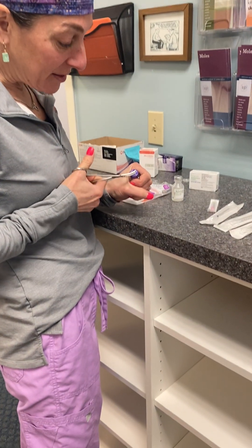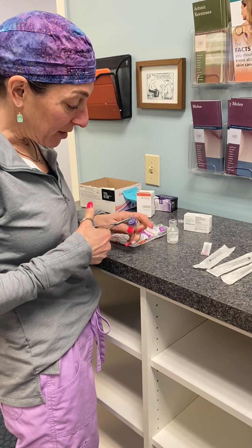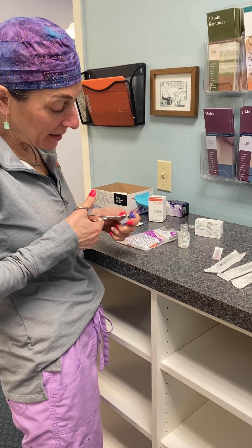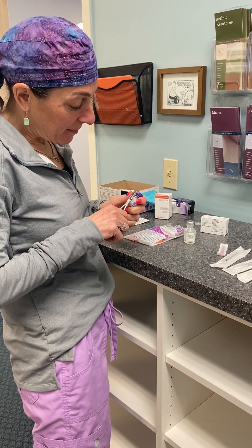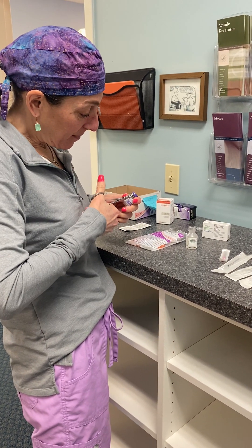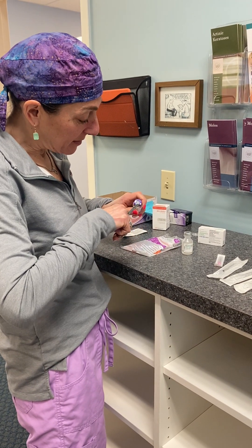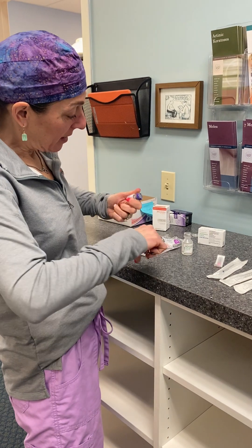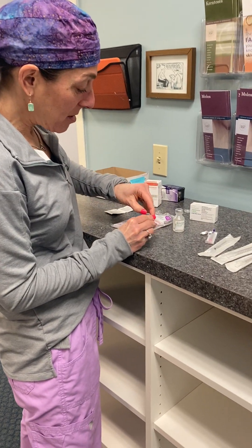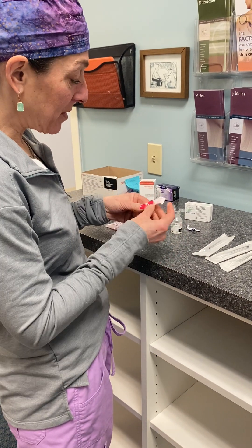With a hemostat, I'm going to pull this lid off — my nurses are better at this than I am. Everyone does this. We're going to get this lid off, then pop the stopper. I've already wiped this off with alcohol.